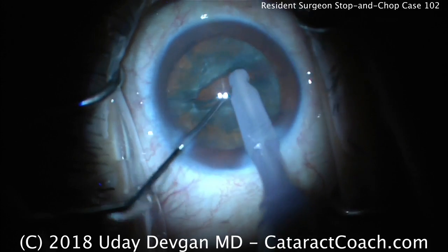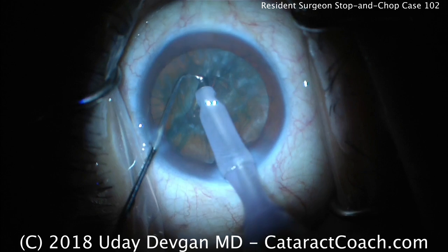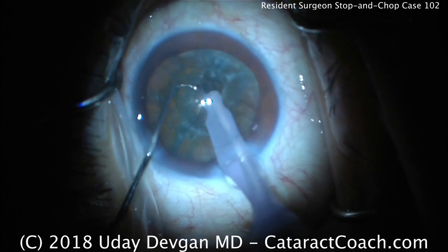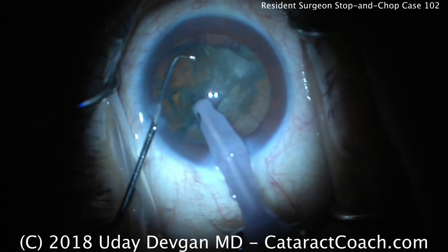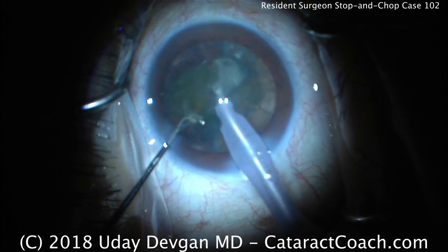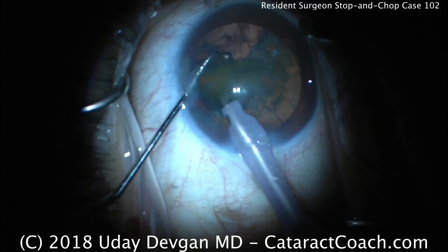Now we go to high vacuum, high flow mode to bring the piece up. Buzzing in the nucleus at the center is going to be tough — I'd encourage you to buzz in towards the end or the edge. You want it towards the corner; it's easier to bring one corner of this half up out of the capsular bag. If you try to hold the middle, it's too big and bulky. Buzz in the probe at the corner of one of these halves — yes, then the half can come up. The chopper goes around it and breaks off a piece. Beautiful chop. Notice the eye is staying in primary position — this is half the battle when you're just starting to learn. A little phaco energy, mostly fluidics to remove the nuclear pieces. We have half in the bag and about a quarter left at the iris plane. Another chop — that's really great.